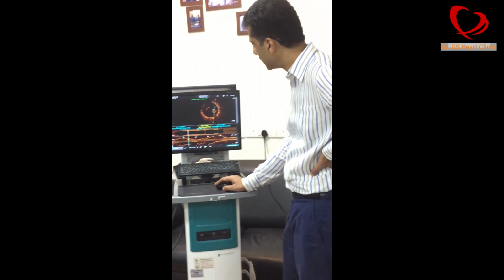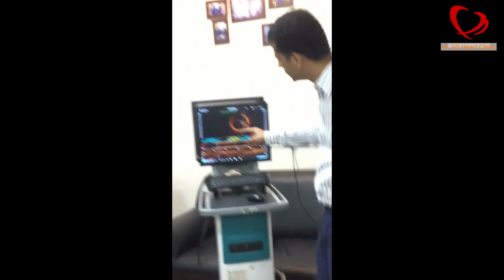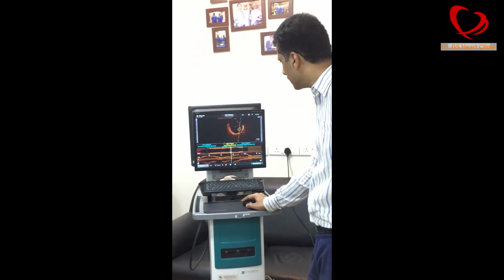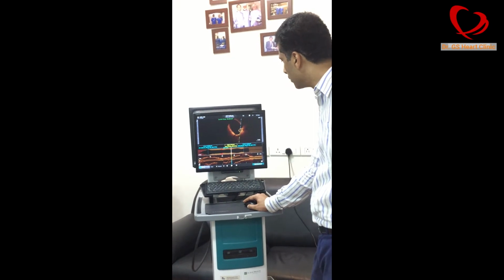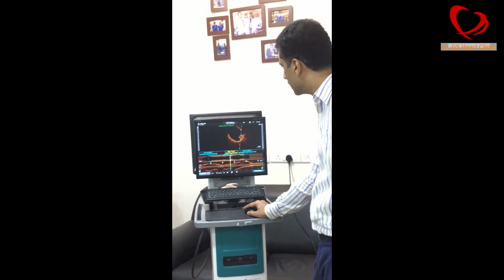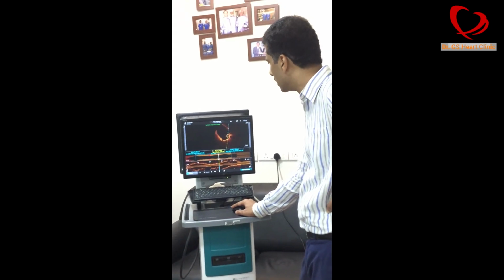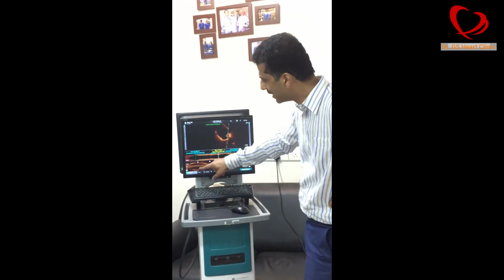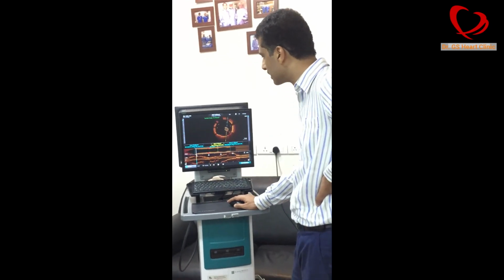If you look at this part, the stent is very well apposed. You see, the stent is sticking very well. And I go to the same ostium. See, the lumen area is now in the same ostium. The smallest area is around 10.8. But we are not satisfied with this. Because, although this is 10.8, there are some stent struts which are floating at the edges.